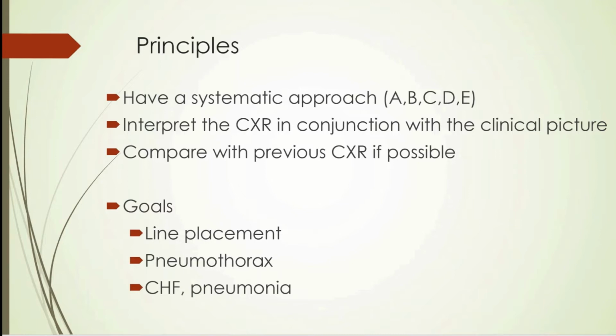So some of the goals of this podcast, especially for ER people and anesthesia people, line placement, obviously verifying any central lines that you put in, making sure that you don't have a pneumothorax either from the central lines or if you get a trauma in or whatever. And picking up congestive heart failures, pneumonias, and things like that.